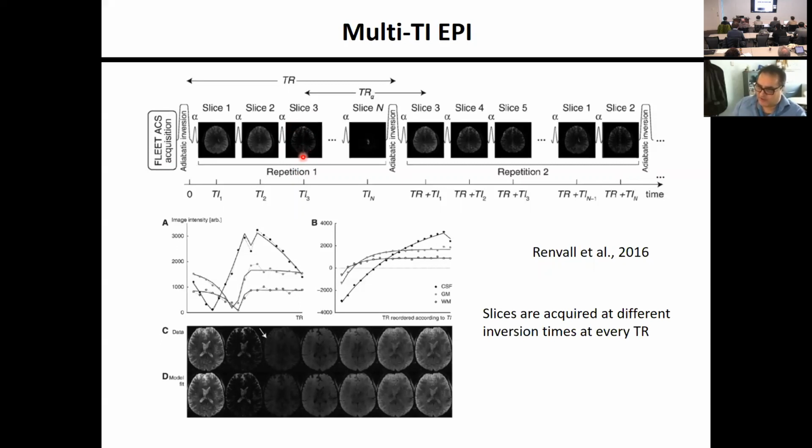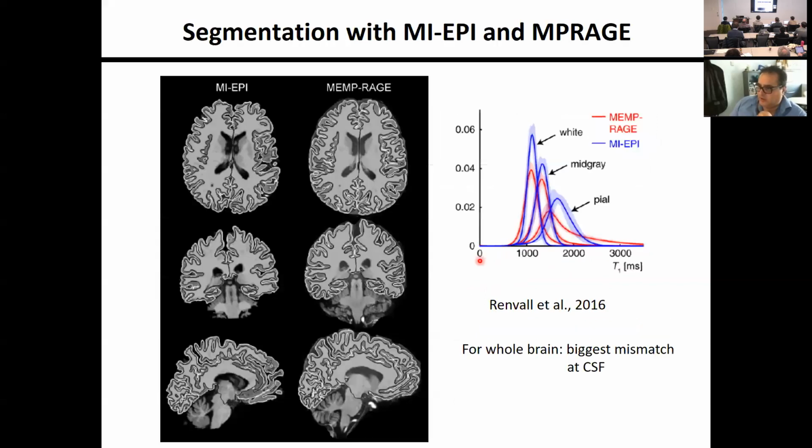In short, in summary, with this trick, we have a T1-weighted anatomy which is distorted the same way as the functional data. We took this idea, and this idea was in this paper. They explored free surfer pipelines, and they explored whole brain segmentation and so on. We took this idea and looked at how it plays out for laminar fMRI.